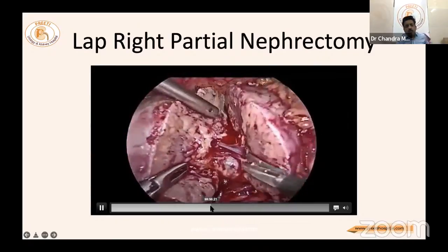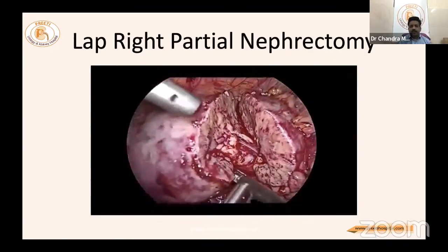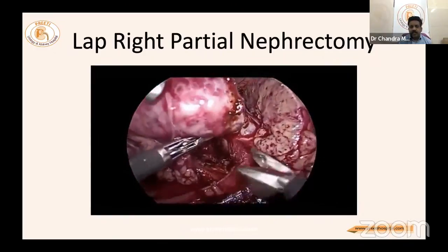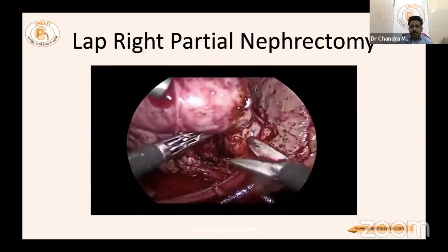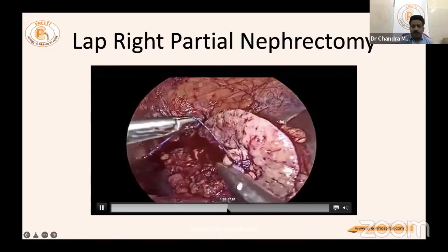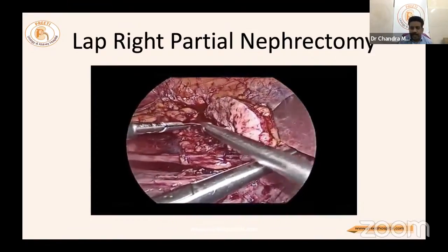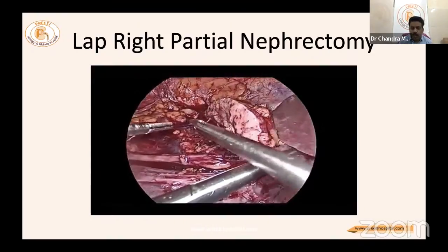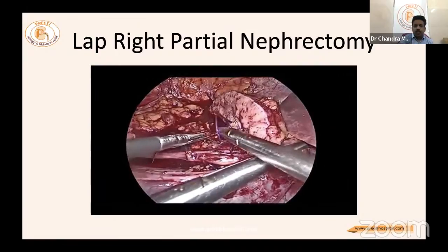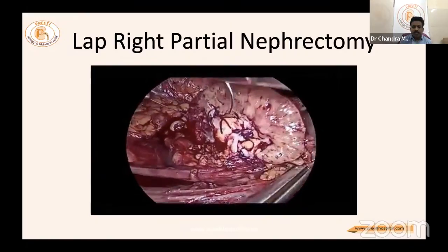The kidney is cut exactly in the center, identifying all structures. The tumor is seen going close to the hilum and is divided after identification. The PCS is then sutured — as in both other malignant cases — because in hemi nephrectomy, suturing of the PCS is invariably essential.